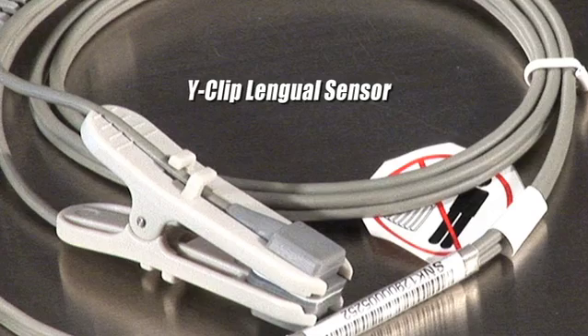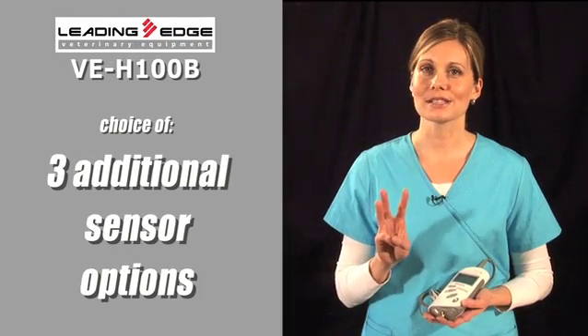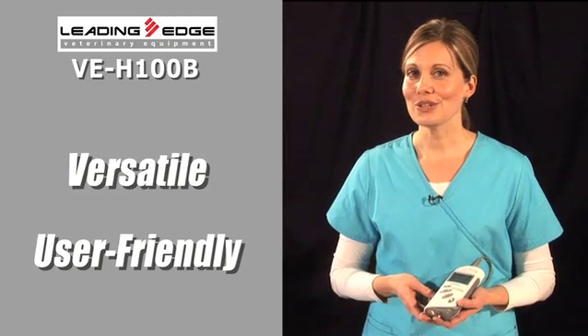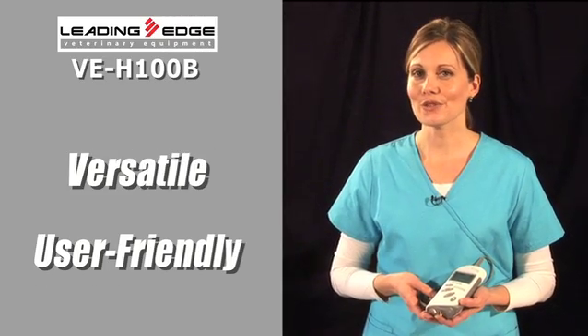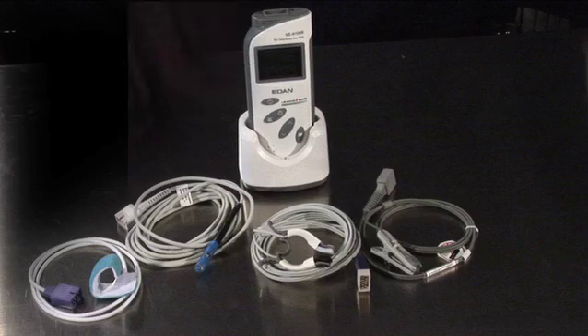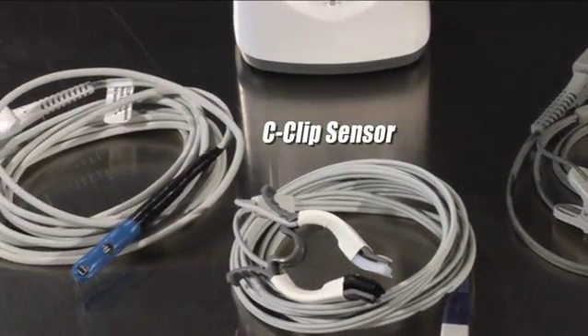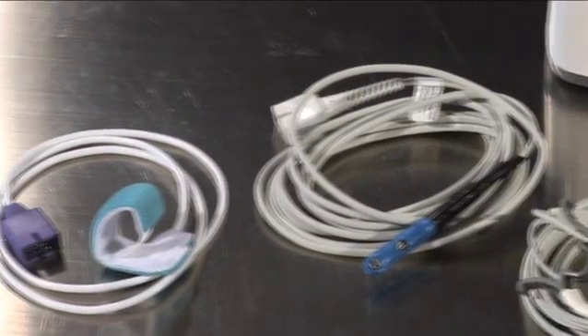In addition to the Y-clip lingual sensor that comes standard, you get an unmatched choice of three additional sensor options with your VEH-100B to make this unit one of the most versatile and user-friendly you've ever used. Count them: the Y-clip sensor, the C-clip sensor, the rectal sensor, and the flex rep sensor.